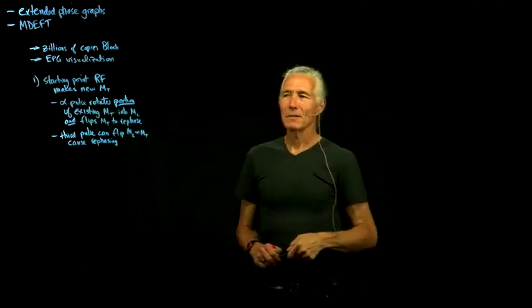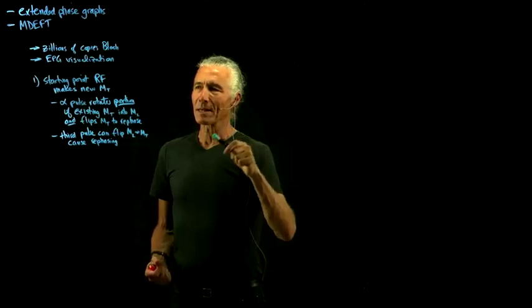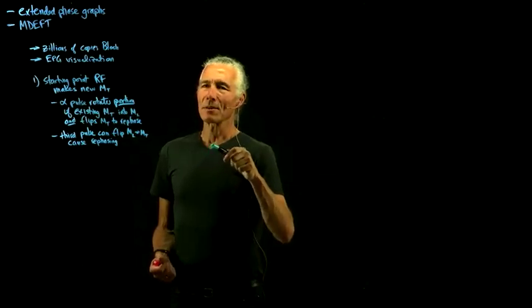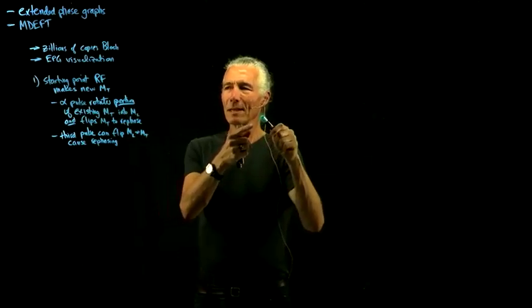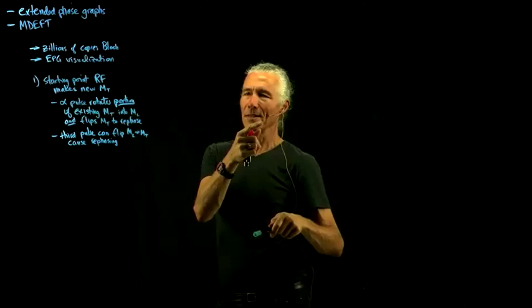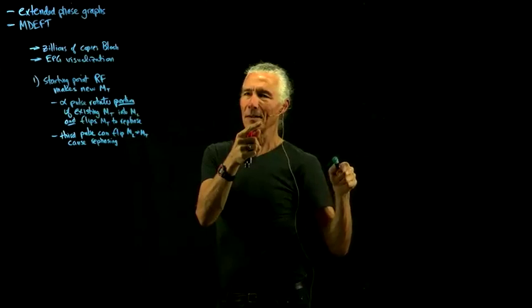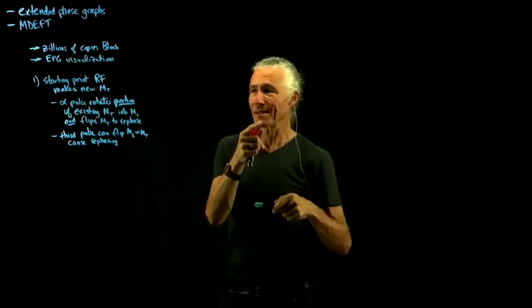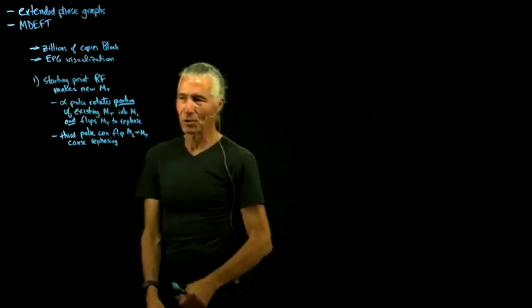And you could dephase in both the negative and the positive direction, but we're going to concentrate on the dephasing in the positive direction, and when we flip, we'll have the effect of flipping us down into the negative direction, and then we'll continue to dephase. But that means we're rephasing.